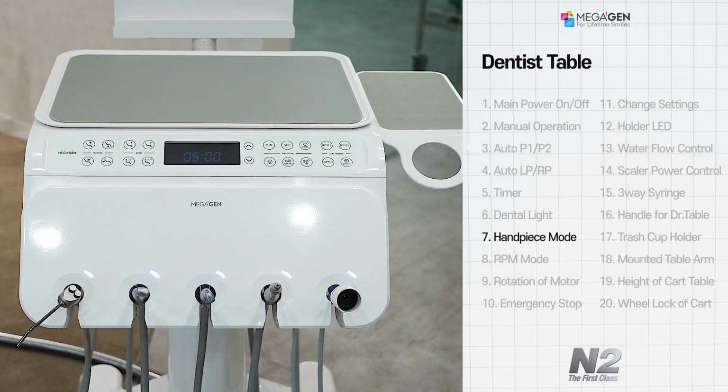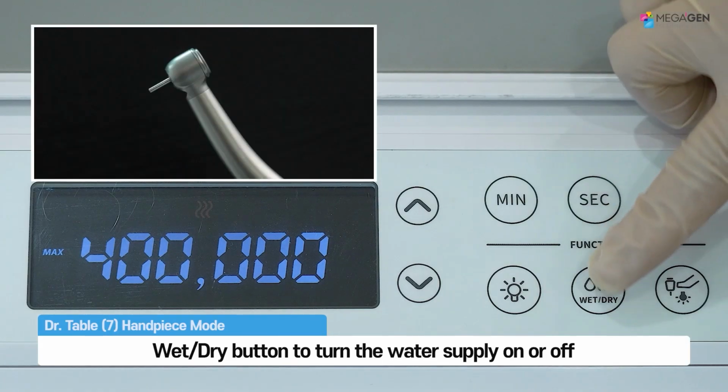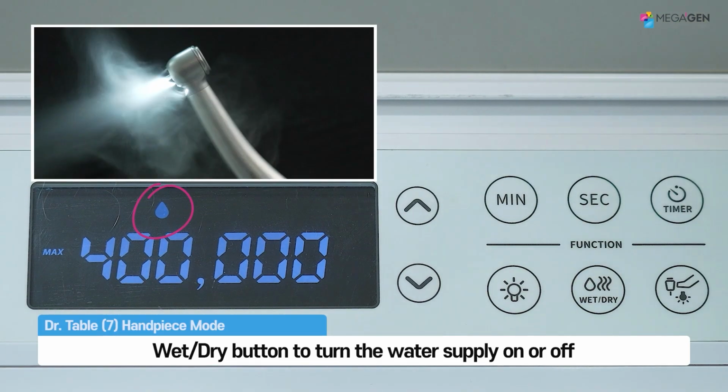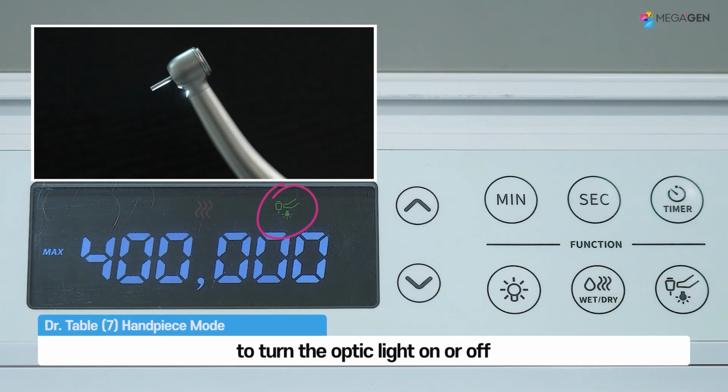How to use the handpiece mode. Pick up the desired handpiece and press the wet-dry button to turn the water supply on or off. Likewise, you can use the fiber optic button to turn the optic light on or off.